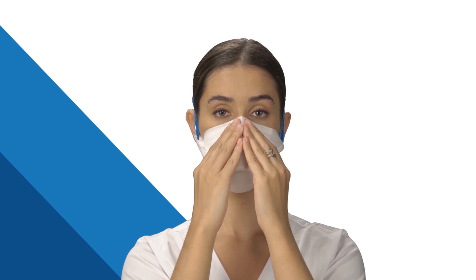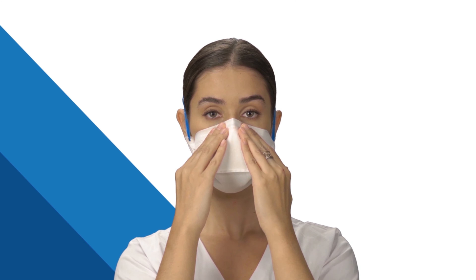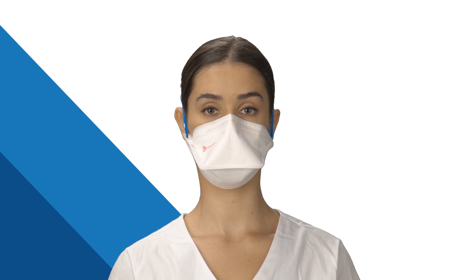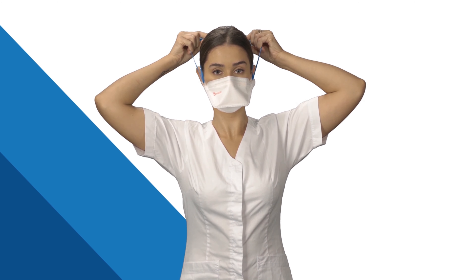If the mask swells without feeling air leakage, you are all set. If you feel any air leakage around your nose, readjust the nose piece. If air leaks around your cheeks or chin, readjust the straps.